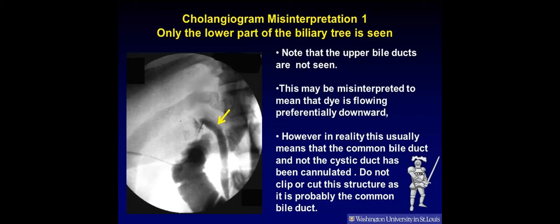Cholangiogram misinterpretation 1: Only the lower part of the biliary tree is seen. Notice in this cholangiogram that the upper ducts are not seen. This may be misinterpreted to mean that the dye is flowing preferentially downward. However, in reality, this usually means that the common bile duct and not the cystic duct has been cannulated. Do not clip or cut this structure as it is probably the common bile duct.